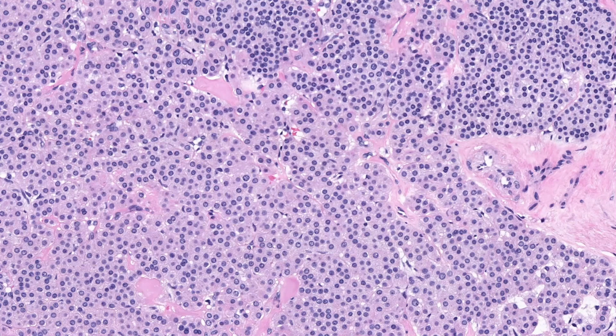They are most common in young women, where they have a strong propensity to be subungual, which means under the nail. All glomus tumors are composed of a variable amount of glomus cells, blood vessels, and smooth muscle, and there are 3 morphologic subtypes based on the relative amount of each of these components. The case I just showed you is an example of solid glomus tumor, which is the most common subtype and accounts for about 75% of cases. It is predominantly made up of glomus cells, and vessels are small and infrequent, with rare smooth muscle cells.